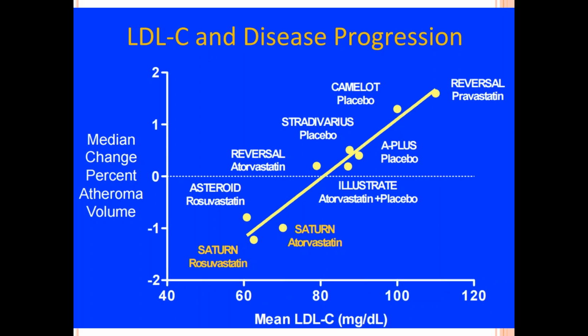And then we've had people that have calcific plaques that we follow over 12 years, and we look at that, and the calcific plaque is unchanged in 12 years because it's an inert, neutral, focal calcific plaque. It doesn't have anything in it that's lipid or that's juicy. It hasn't seen a lipid for 12 years for some reason. And these are patients that are one and done. I believe that those are people that don't have the inflammation that other people have.